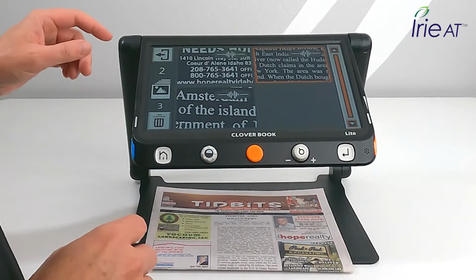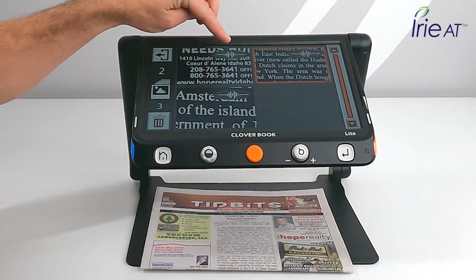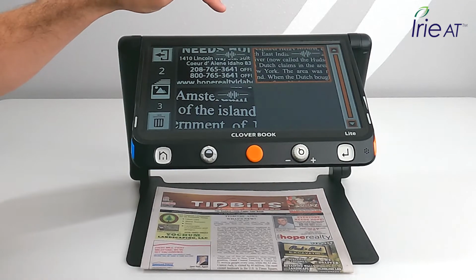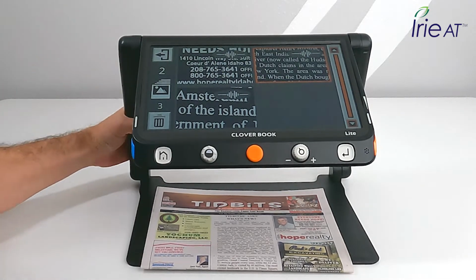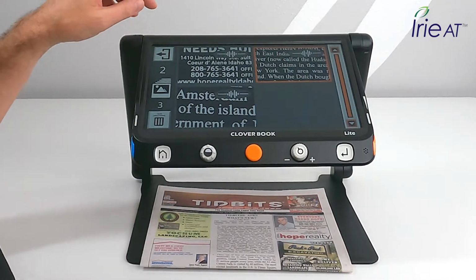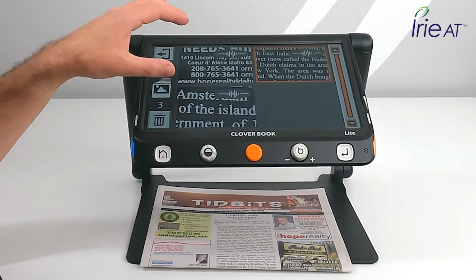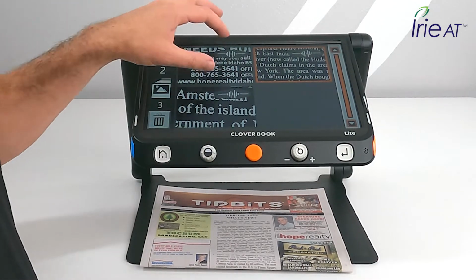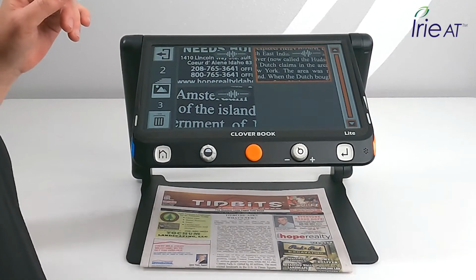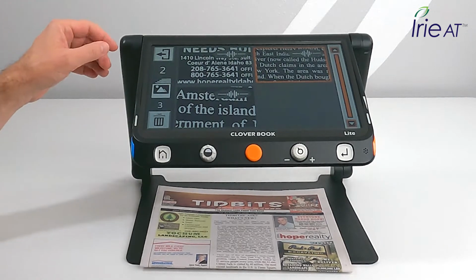So I'll go back, and in here, if I have a voice on them, then there's a visual indicator of that. This is my favorite recipe, Yahoo. And when I press that, again, it's really quiet, but I can turn that up. Anyway, it's a real nice way to figure out what they are rather than trying to look at the image and say, I don't know what all that stuff is. Now I can just, oh, it's my favorite recipe, Yahoo. And then you can trash them in here, move them around, whatever.